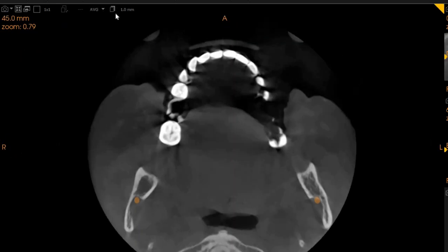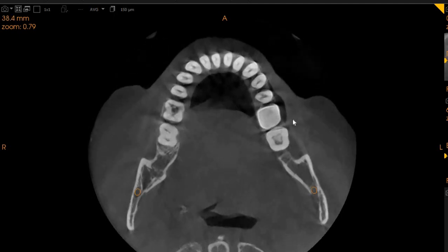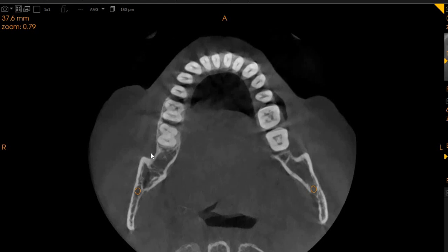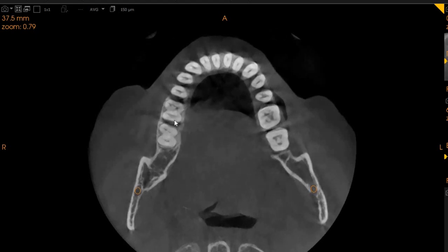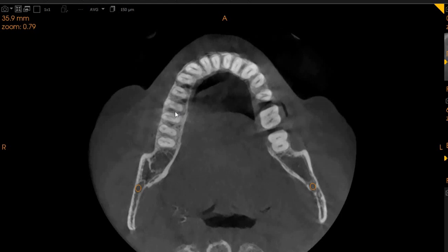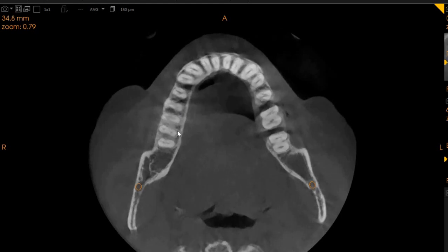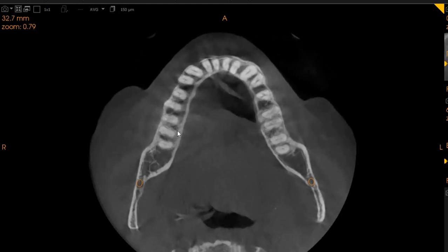Now I'm going to show you the axial view, which is the top to bottom view. Here again, you can very clearly see we've got two canals — very sclerosed canals. Two canals in the mesial, two canals in the distal, which then join to form one at the apex.